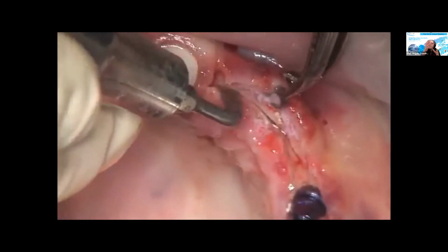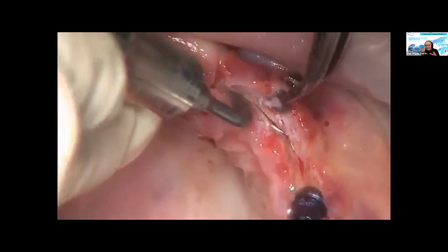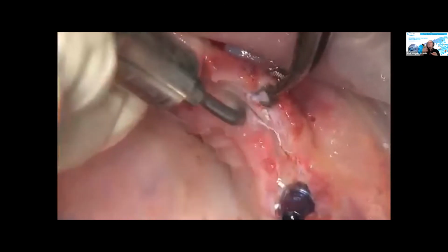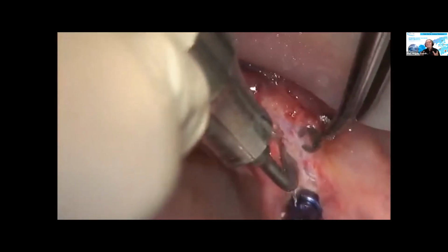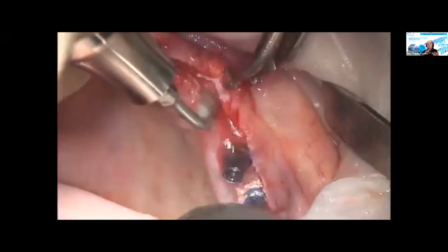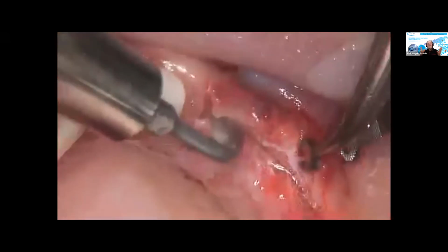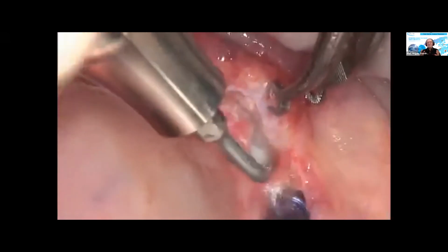And you see, of course, there's progression, and this is real time. This osteotomy is real time. If you check your stopwatch, it takes 2 or 3 minutes. What are 2 or 3 minutes? Nothing, okay? But from your perception, since there is not much action, there is no bleeding, there is no stress on your side because of soft tissue safety and precise cut, everything seems to take longer.